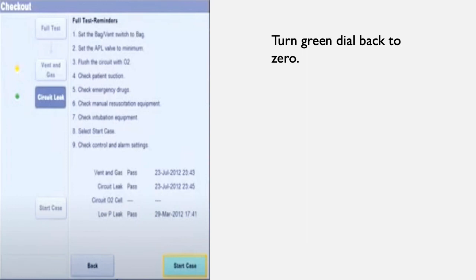If all these tests pass, this screen will pop up and you will be ready to start your case. Thank you for listening. I hope you find this helpful.